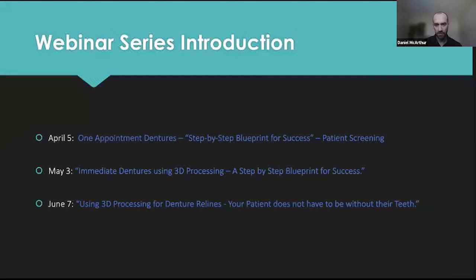Perfect. All right. How do we address OVD adjustment issues during immediate denture fabrication? Honestly, if a patient has enough teeth and a stable bite, that's the bite I go with, because the reality is when they heal, the gums are going to shrink and you're going to lose VDO anyway. So I don't get focused on it at the first delivery of the immediate denture. When we do the second denture, at 3 months, that's when I assess. I've had patients come back wearing their denture and you can't tell, because they've shrunk so much that the denture, when it was delivered, they had a smile, they had teeth, but because they've had so much bone loss, perio, whatever, it's shrunk so much.